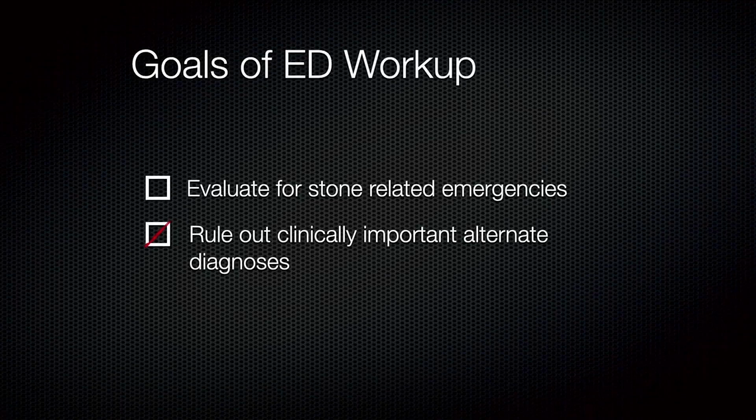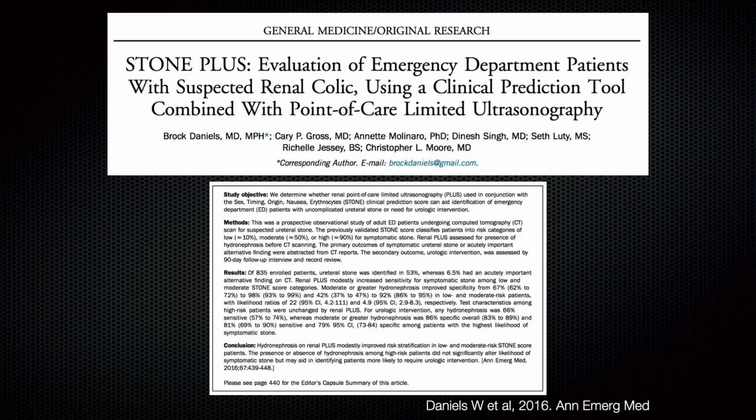And basically that takes us where I want to go with the rest of our time here, and that is looking at what's called the STONE PLUS score, right? So they basically did the STONE study, right? And they said, well, what if we add ultrasound to that? Does that help us improve our test characteristics in the diagnosis and management of patients with kidney stones, right?